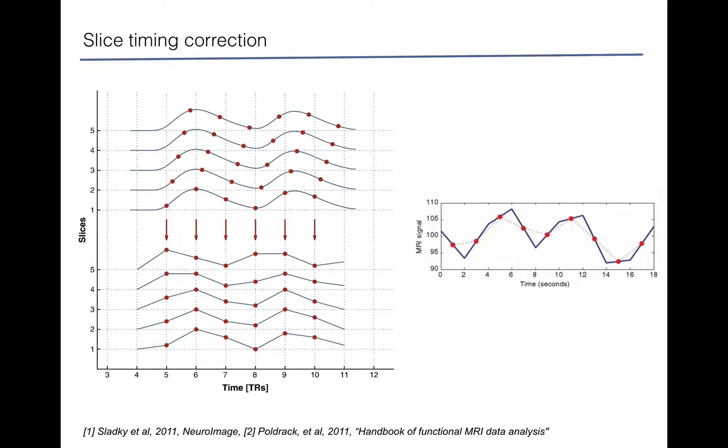If you're doing resting state, that's where you have to do the slice timing correction. But if your study has a task, then you can model these slice timing differences in your GLM by adding the derivatives, for example.